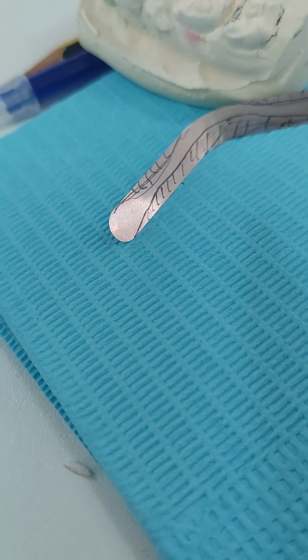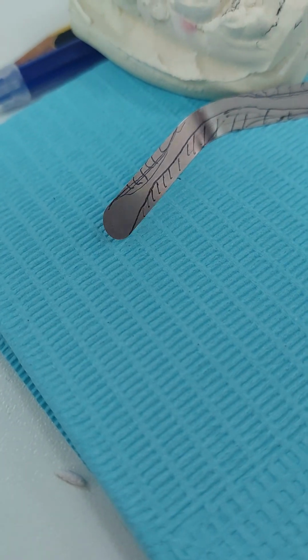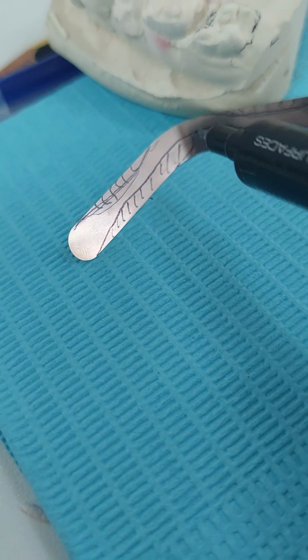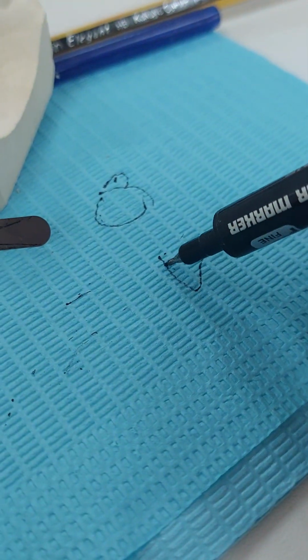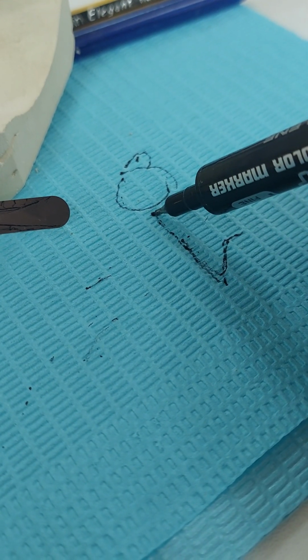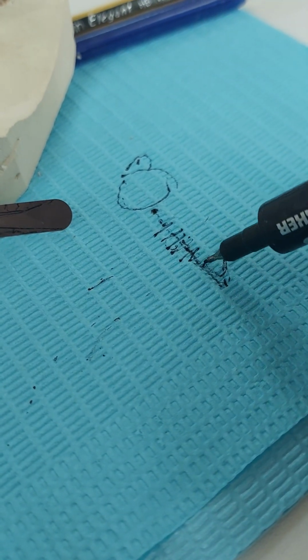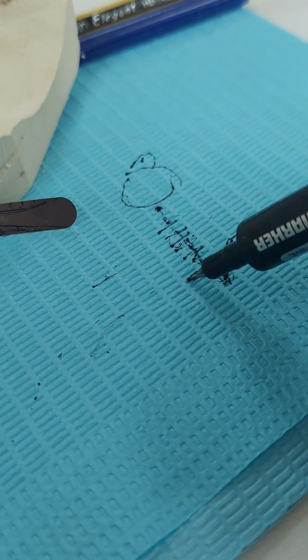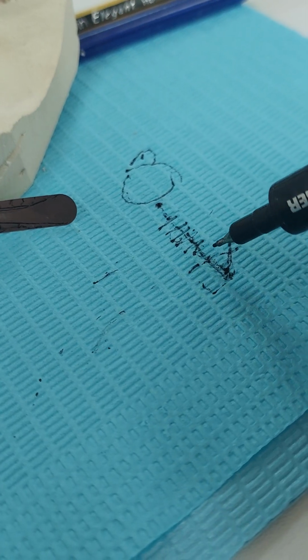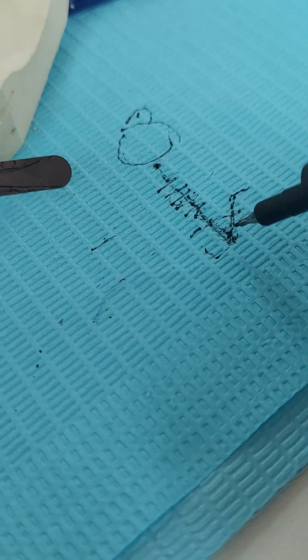And we remove all of the height because we don't want it floating in a vertical motion, because we want an emergence profile. If I don't remove this, the matrix will fit in the deep marginal area, but it will be going straight upwards. When I remove this part of the matrix above this gingival area, it will become short. It will only be floating from the deep gingival margin upwards only 2 millimeters. But this is sufficient for me to get a seal and to build a base, from which later on I will use the regular matrix and continue my work.